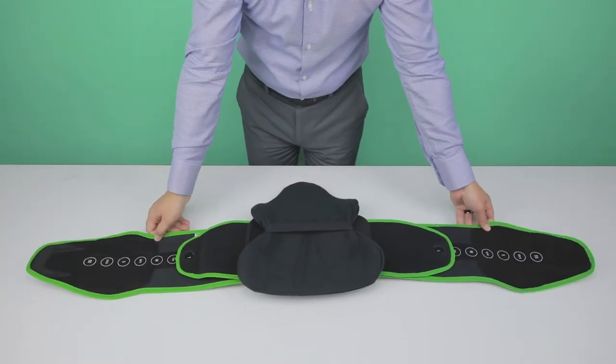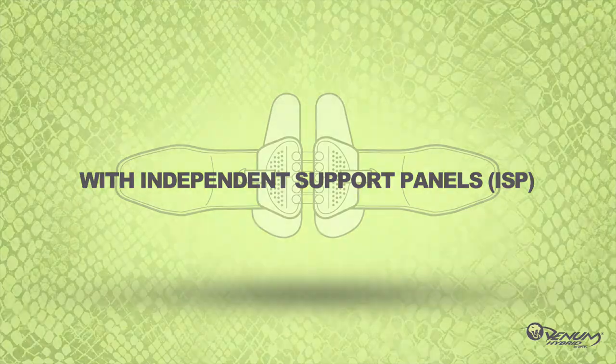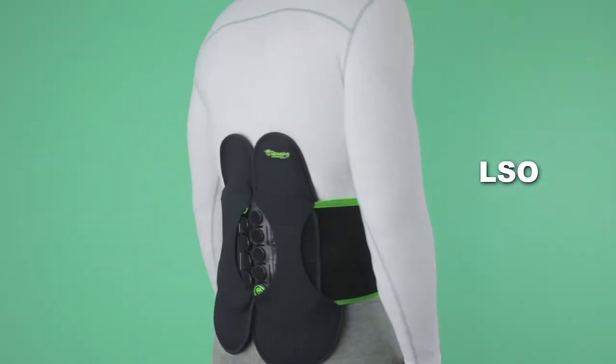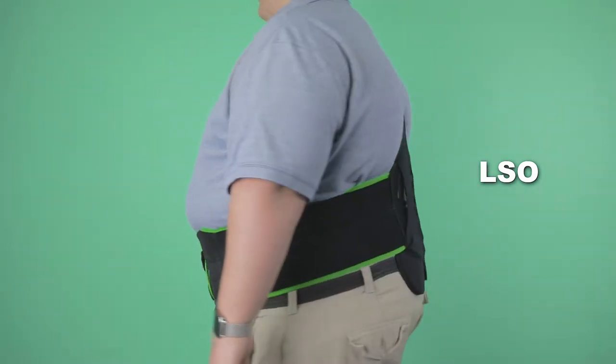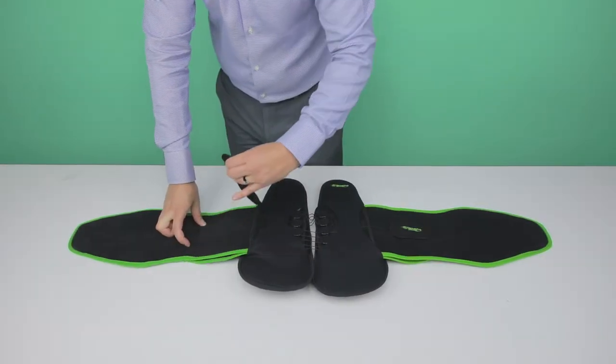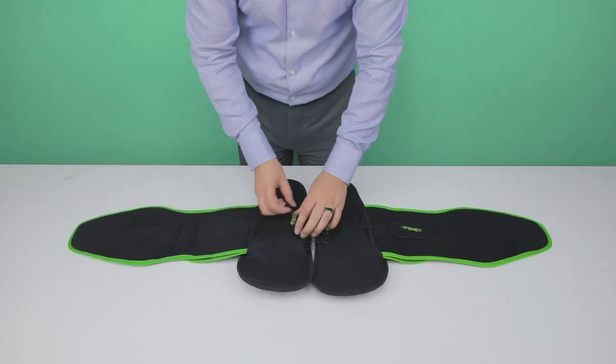The new Venom Hybrid is also available with two independent support panels in a one-size-fits-all LSO configuration. To remove the back panels, attach both right and left pull handles over the round loop circles.